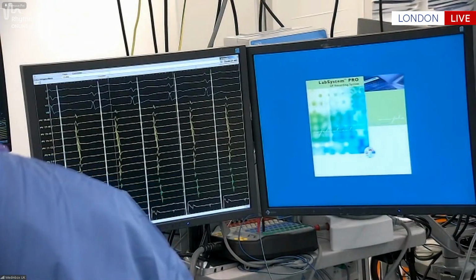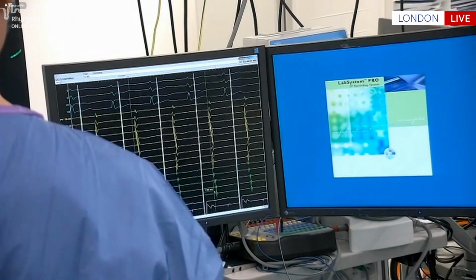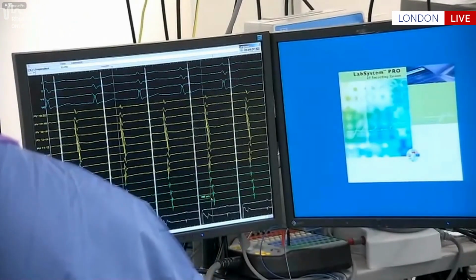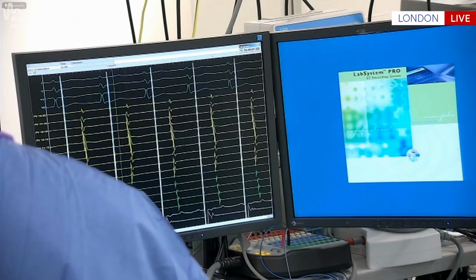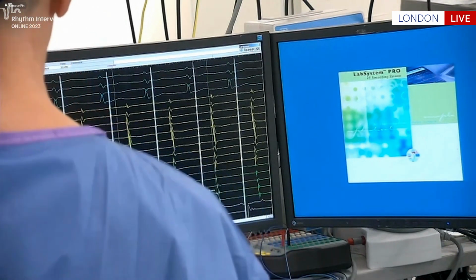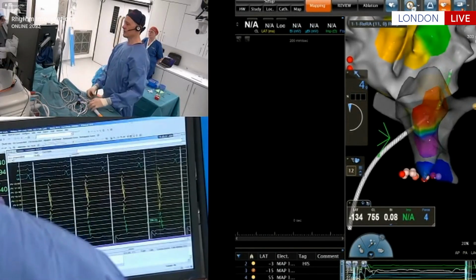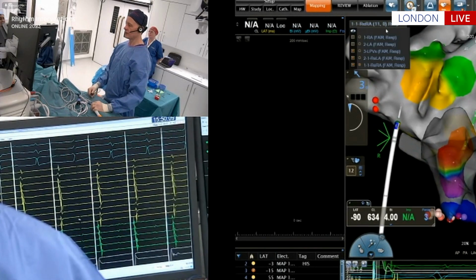It was quite interesting when you looked at the mapping signals on the isthmus, they were actually later than CS distal, and that's simply because the CS is quite a long way around the annulus. Do you want to try and grab it now? So that's 190. I've moved the map closer to the line. Make sure this is later, Manpreet, otherwise you're in trouble. 196, okay, 198, okay, great. So I think we've got block, and we saw a definite step out in conduction time. So I'm going to go back into the left atrium to sort out that right lower.